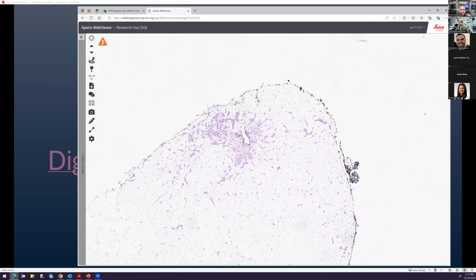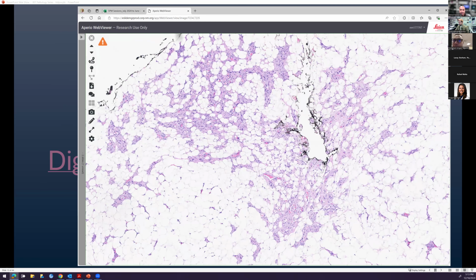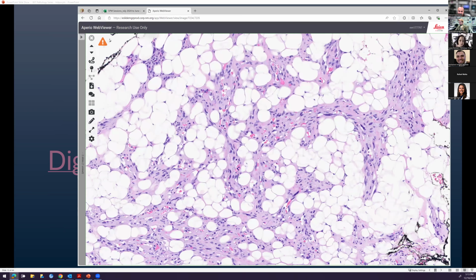Since you started, why don't we continue on with you here? Okay. There's some spindle cells in these septi, some of which are fairly large and hyperchromatic, at least at this power, and there's intermingling vasculature. Okay, so we have some spindle cells, we have some intervening vasculature. Let's take a closer look at these.